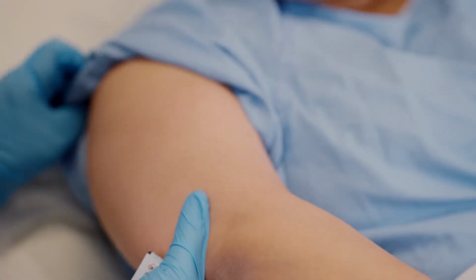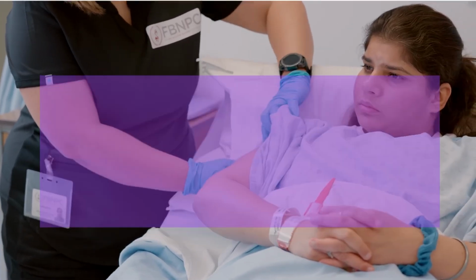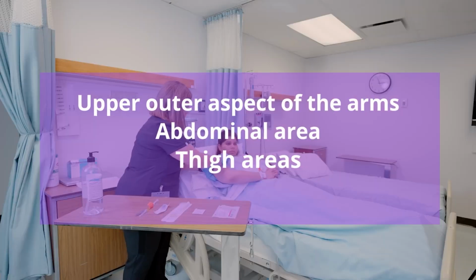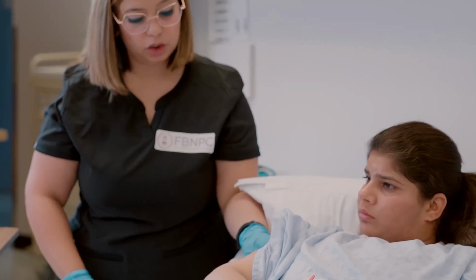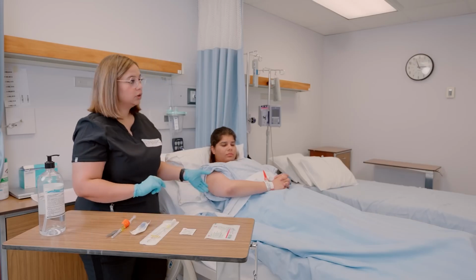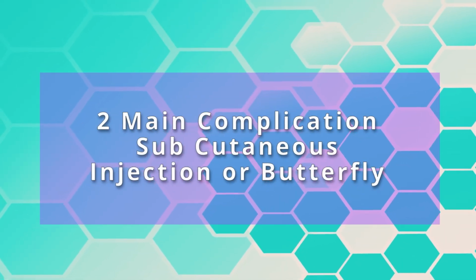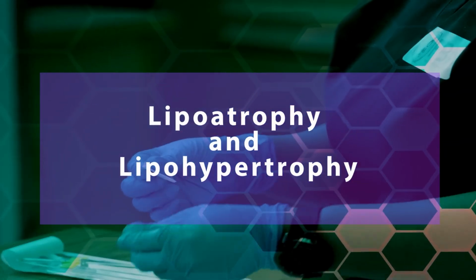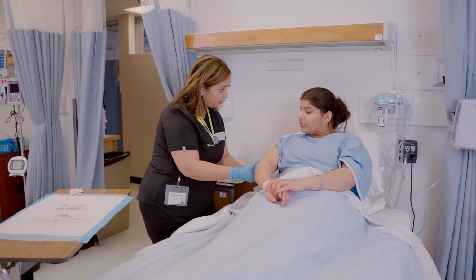Select the subcutaneous sites, which can be the sites we use for subcutaneous injections. For example, upper outer aspect of the arms, abdominal area, thigh areas, and under the scapula. Sites must be changed every 7 days to maintain the patency, and sites must be rotated to avoid tissue damage. Two main complications of subcutaneous injection or butterfly are lipoatrophy and lipohypertrophy. To avoid these complications, site rotation is a must.